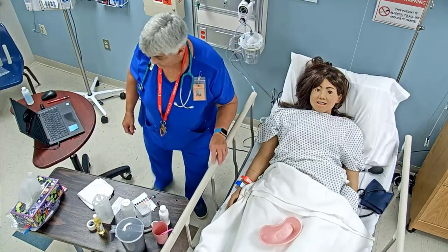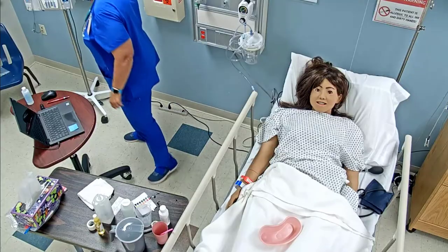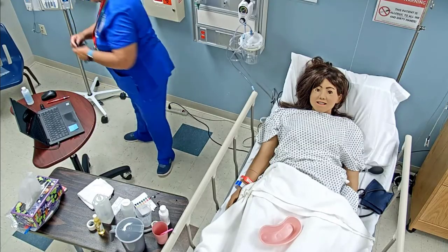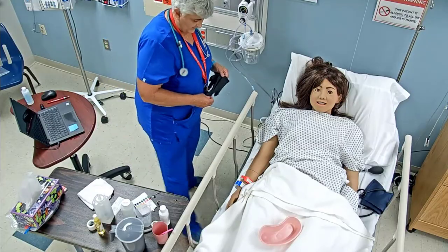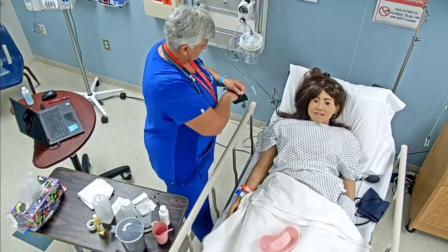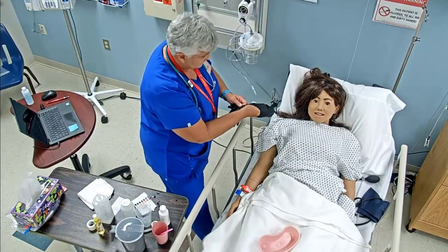Once I've taken care of my patient and got them into a good, comfortable position, I'm going to be putting the bed down into the lowest position, side rails up times two.